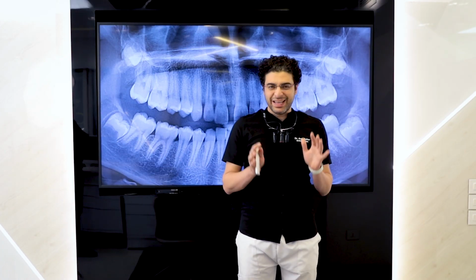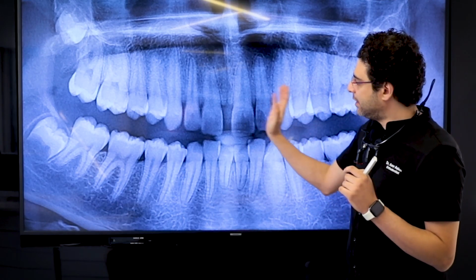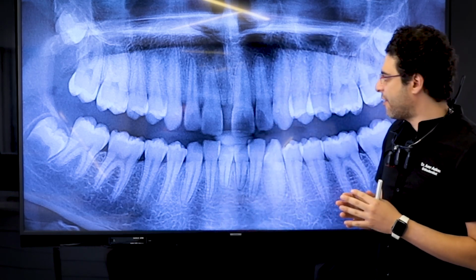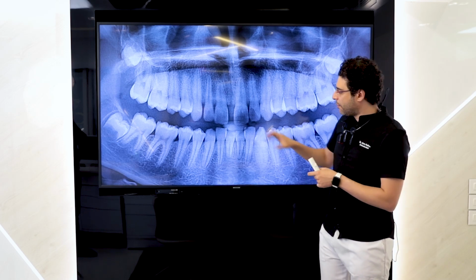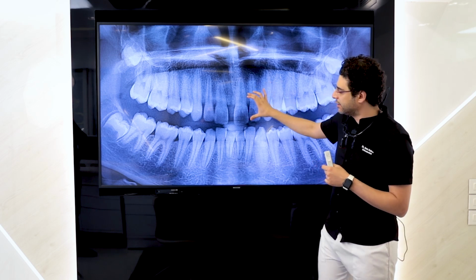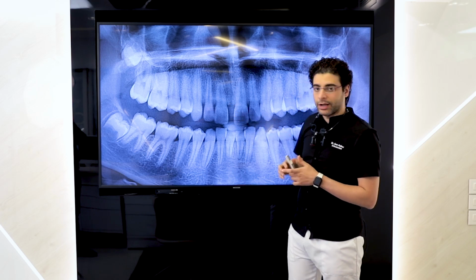The big issue in these types of cases is the angulation. If you don't move the teeth accurately, with bodily movement, in some cases you can find black triangles between the 2 central incisors, and it will affect the patient's aesthetics. So here we should move the upper central incisor, crown and root, almost bodily, and the same for the laterals and canines, and on the other side the same, to avoid any black triangles.